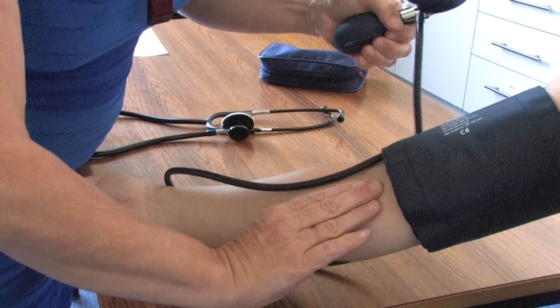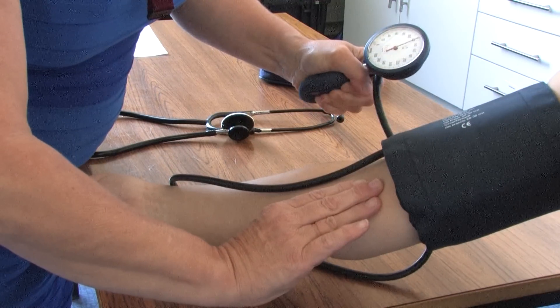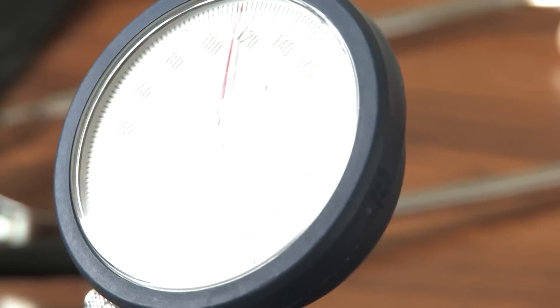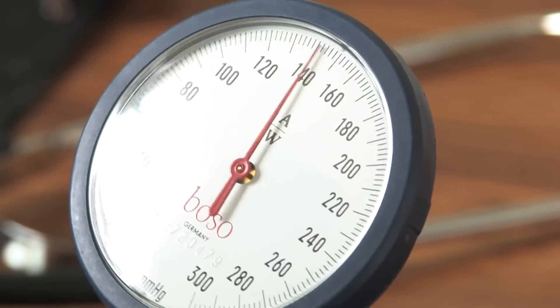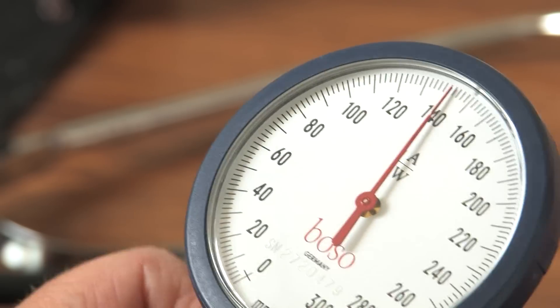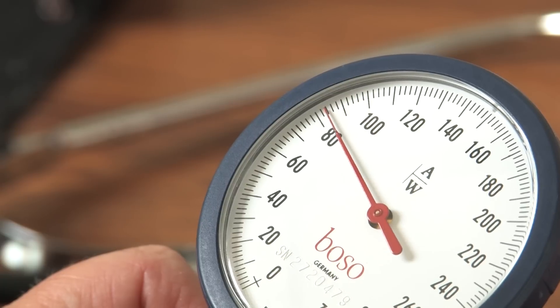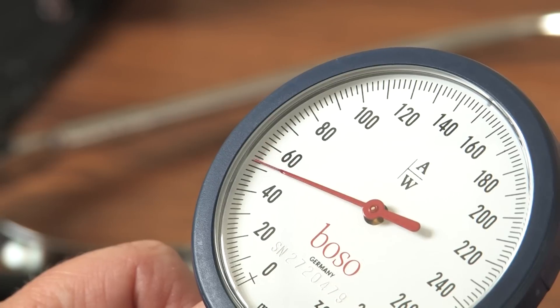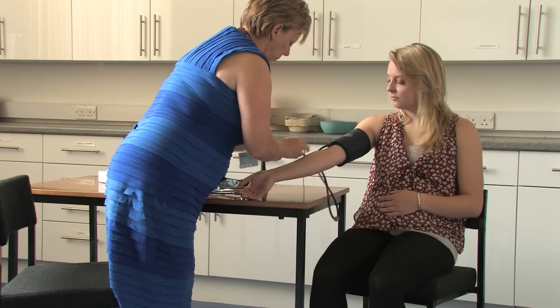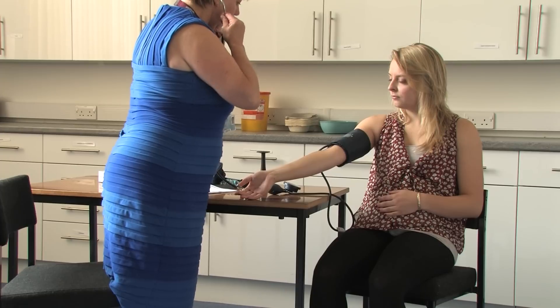Ensure the valve on the balloon of the cuff is closed. Whilst palpating the brachial pulse in the antecubital fossa, position the sphygmomanometer so that it is level with her heart. Pump up the cuff quickly until the pulse is no longer palpable, then slowly deflate the cuff until the pulse is palpable — this gives you the approximate systolic reading. Now quickly deflate the cuff by opening the valve fully. Wait for one minute if using the same arm to allow circulation to return fully.